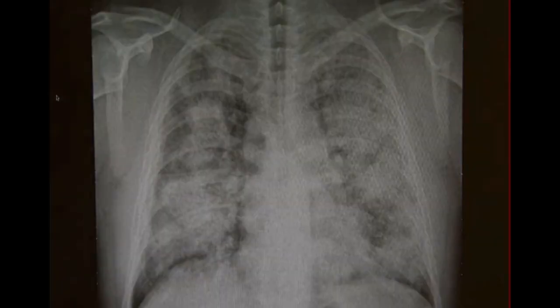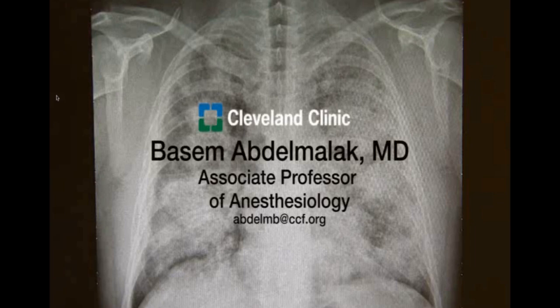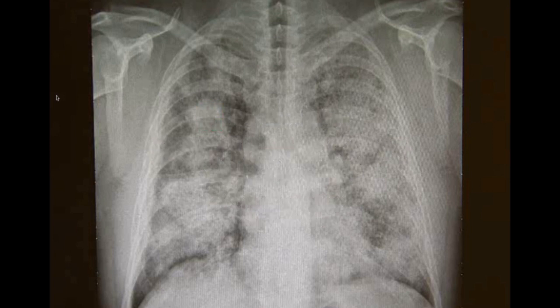This is a brief video showing a synopsis of the whole lung lavage procedure. My name is Bassam Abdelmalek, a staff anesthesiologist at Cleveland Clinic. It starts by examining the chest x-ray, where we're trying to determine which lung we will start with first.